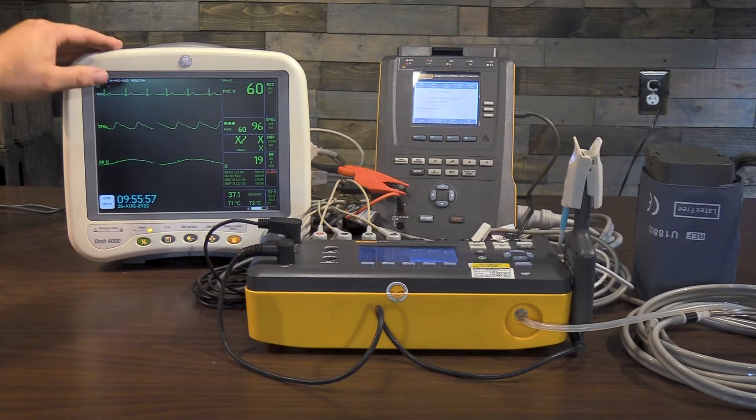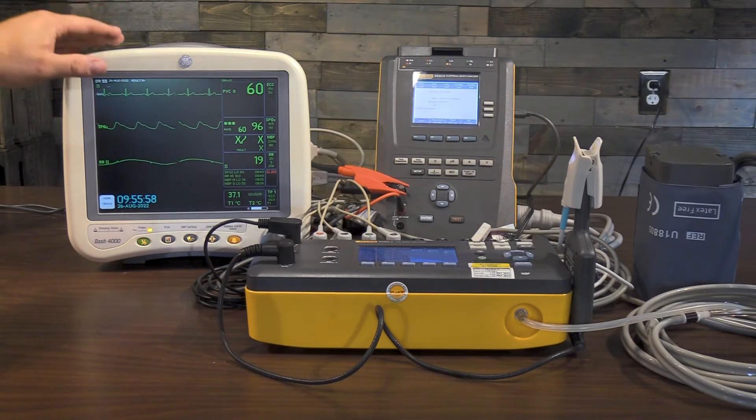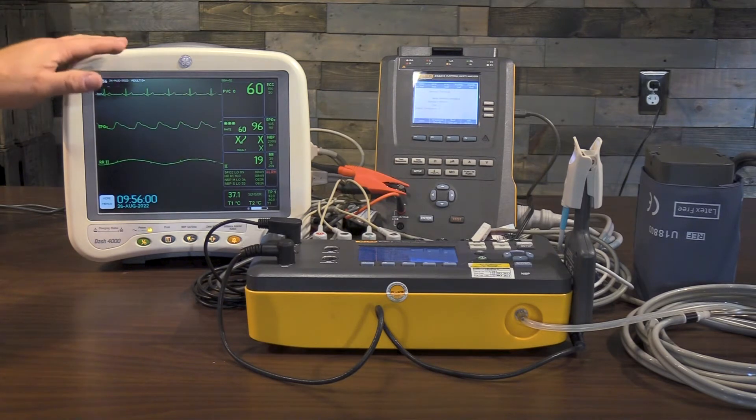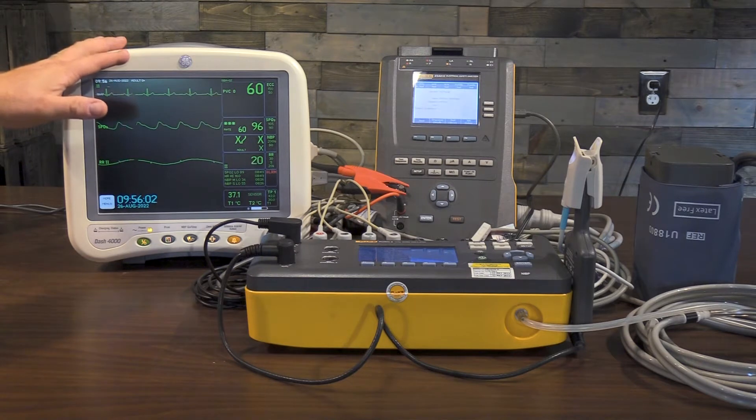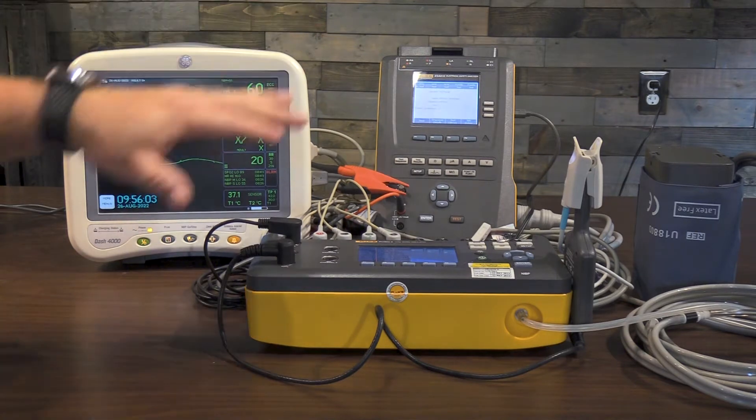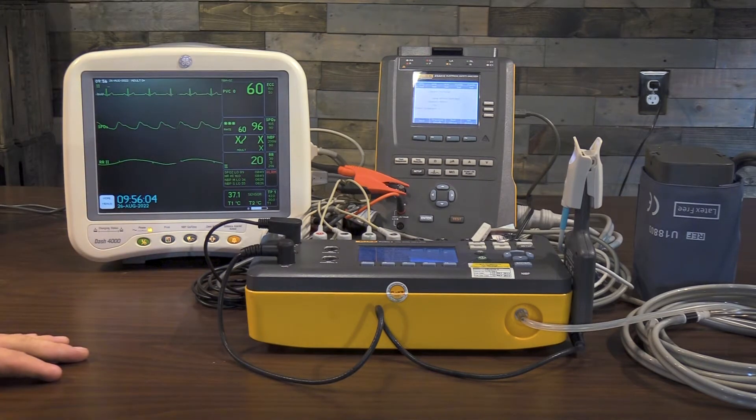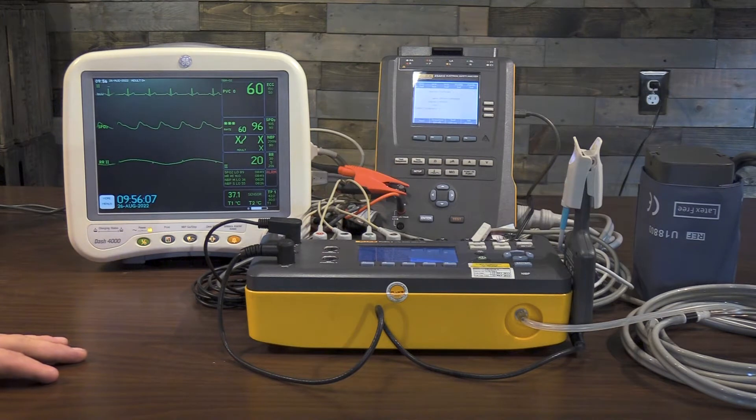Please note, this is not a standard PM procedure taken out of the manual. This is something we just built and made up to show you some of the highlights of the Fluke Biomedical System. Alright, let's get into it here.